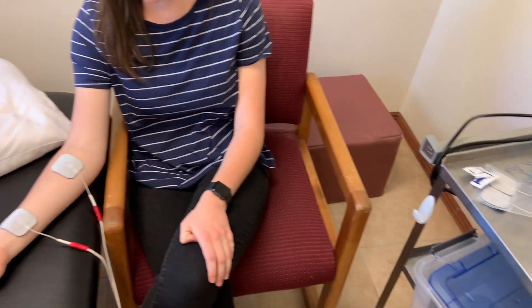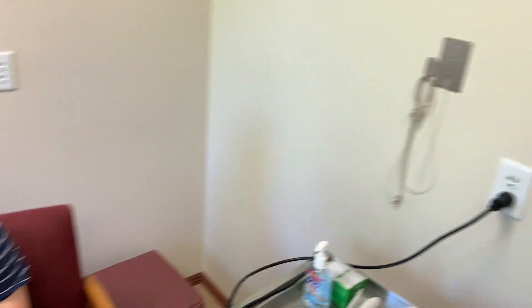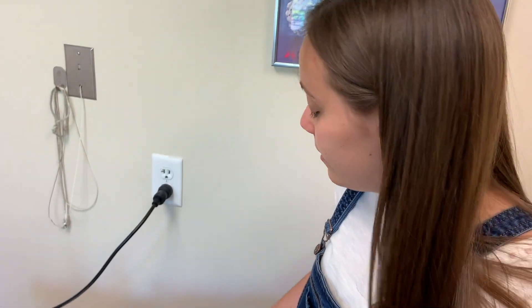Before you adjust the pads, make sure that you turn the electrotherapy all the way down before you move the pads. Otherwise, you'll shock yourself or the patient — or both — and that's not fun.